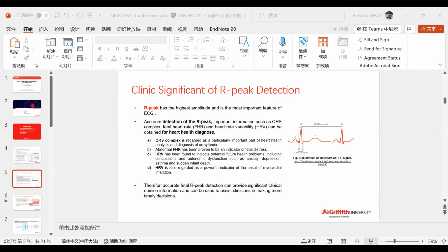And the last step is segmentation. We use a fixed sliding window of 1,000 sample points, which is equivalent to a 4 second long signal range. And the shift update for the sliding window is set to 200 sample points for this work.